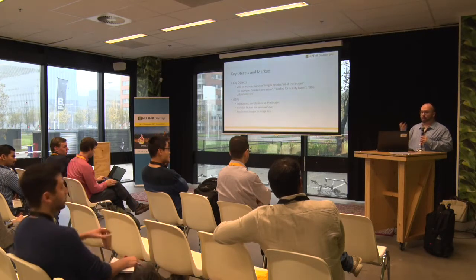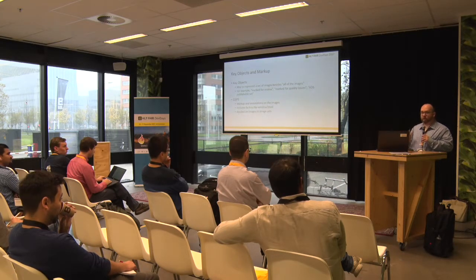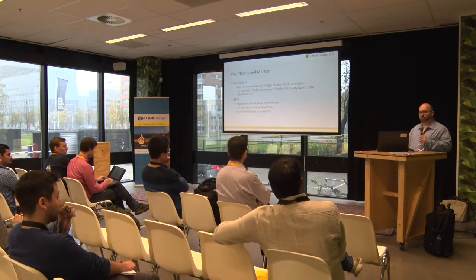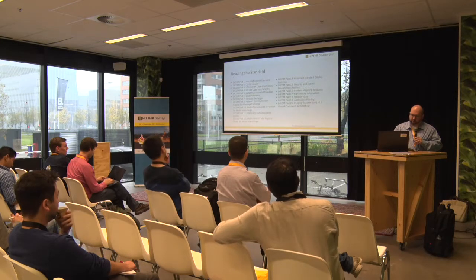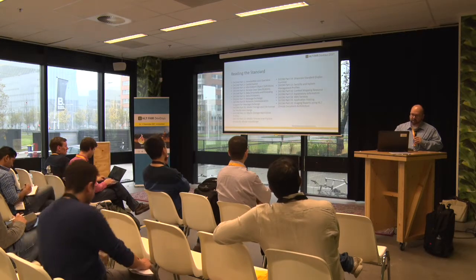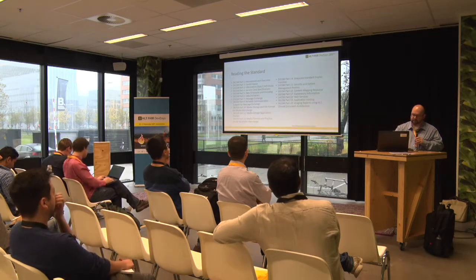And a radiologist could choose to display that on top or not. So we'll have two objects. One is the image itself, and the other is the markup that goes on top of it. All right? So yeah, if you like some light reading, you can read the standard. There's 20 parts available on the DICOM website.